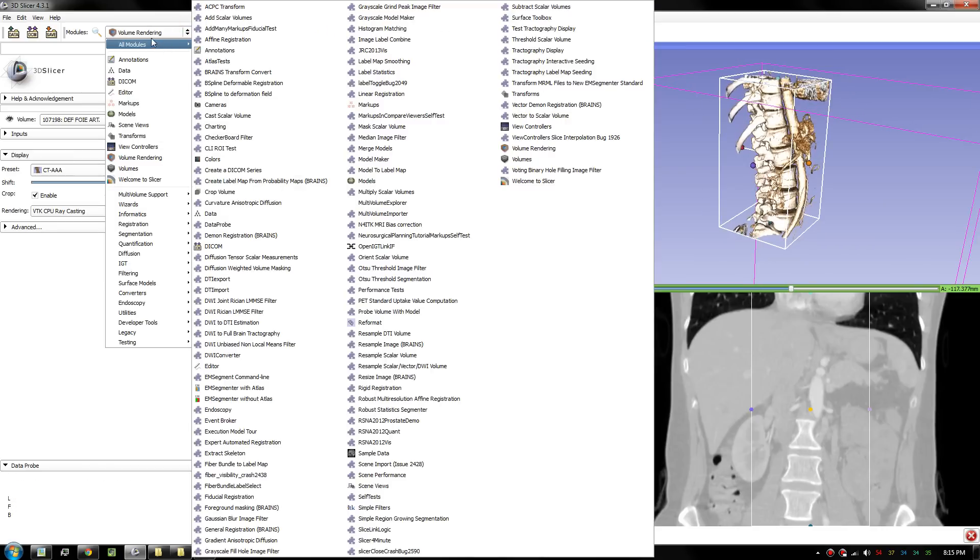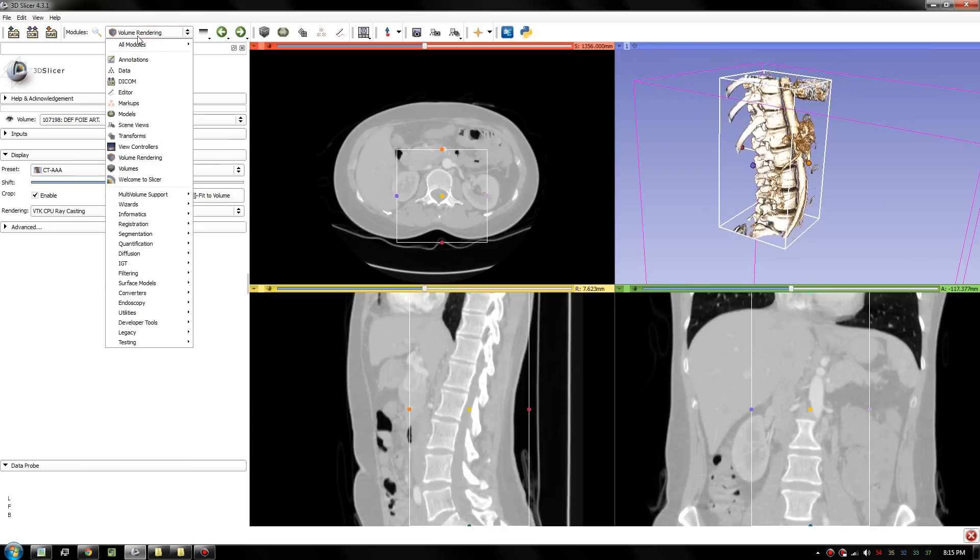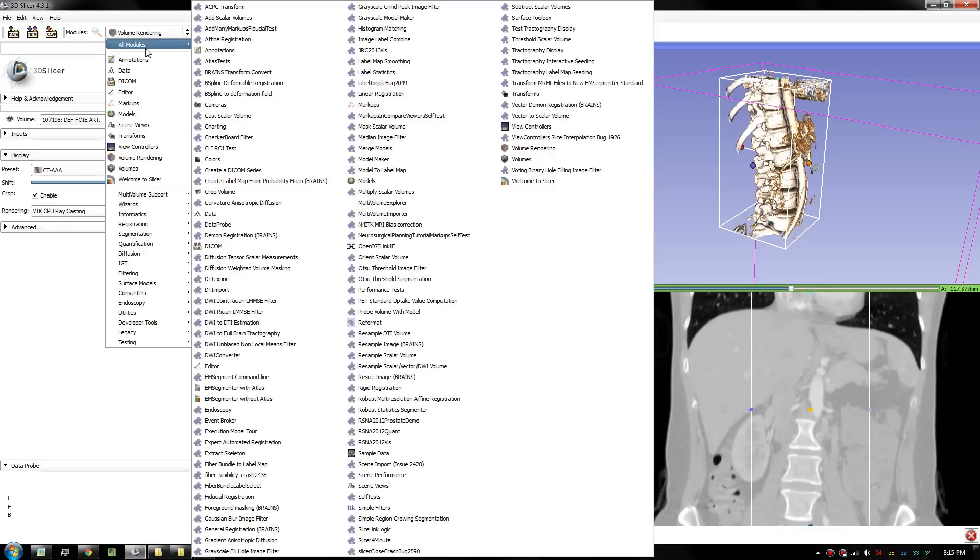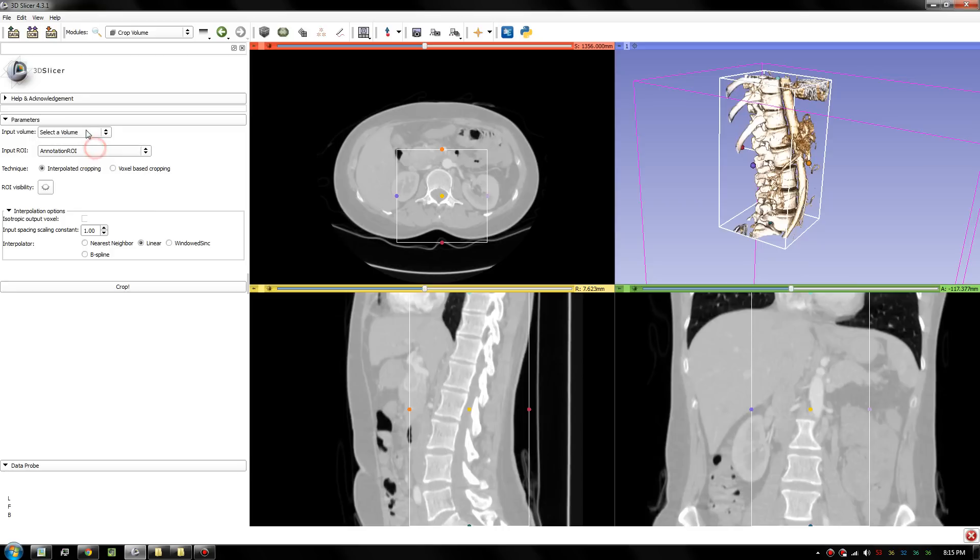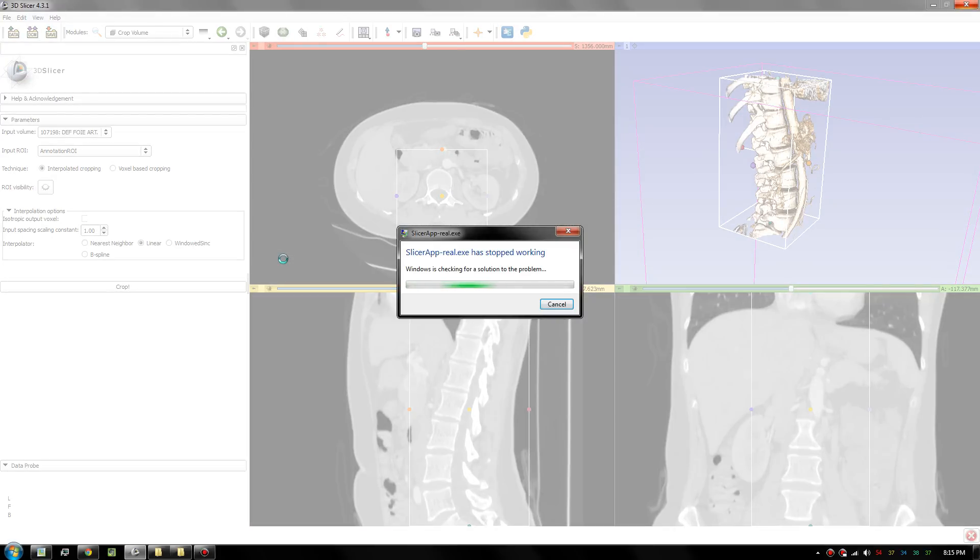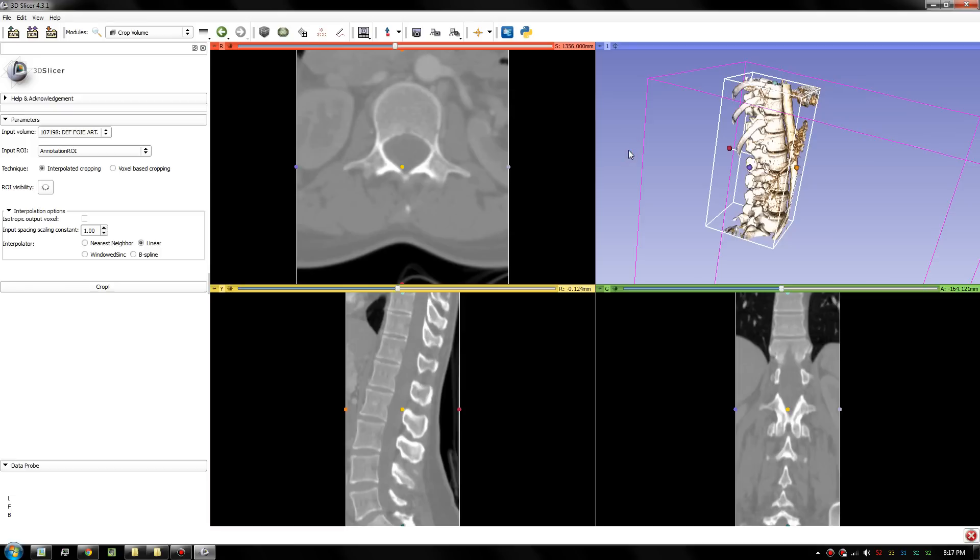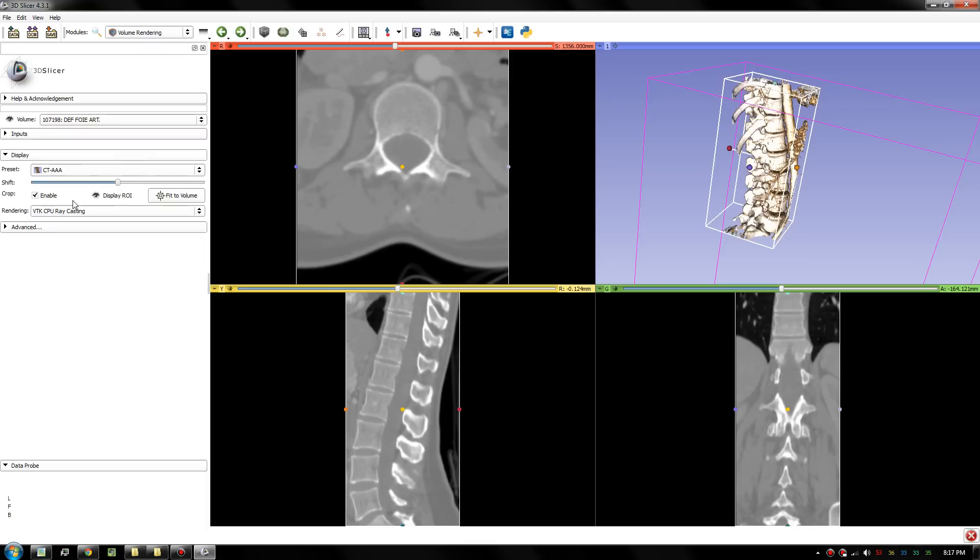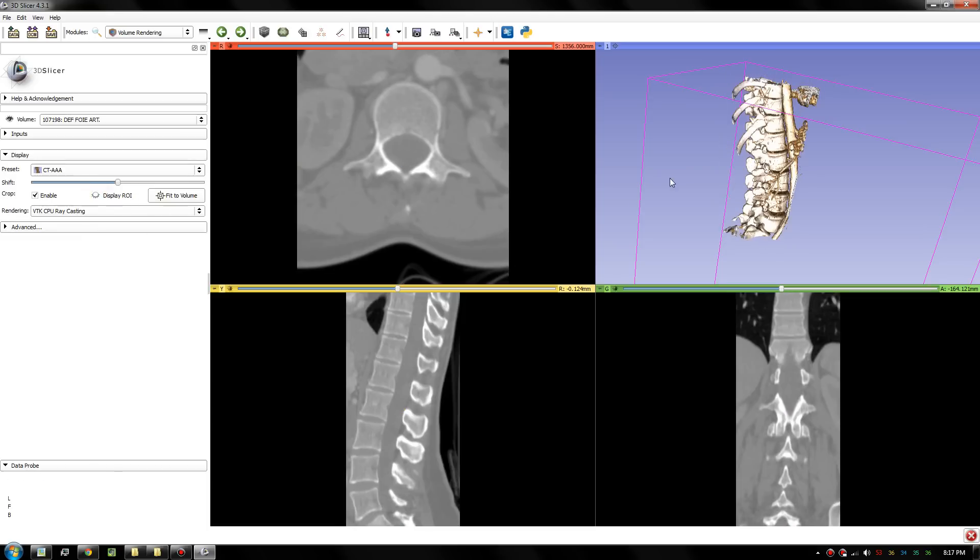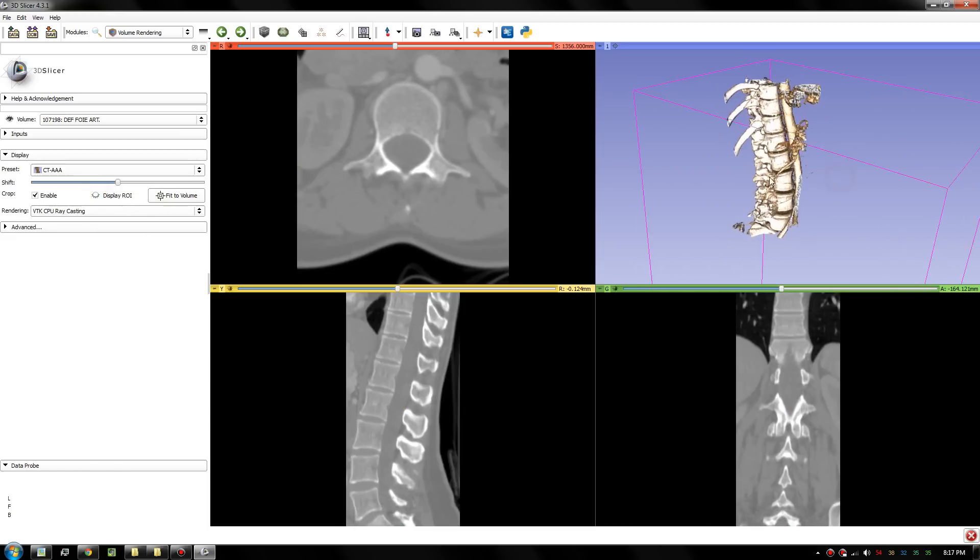Let's retrieve that model. In volume render, we have a range of modules here. We can go to crop volume to just crop the information to that region. Make sure you select the volume and crop. When it's done, it will cut all the data into that area. Let's hide the box. To hide the box, we'll go back to the volume render and hide that.